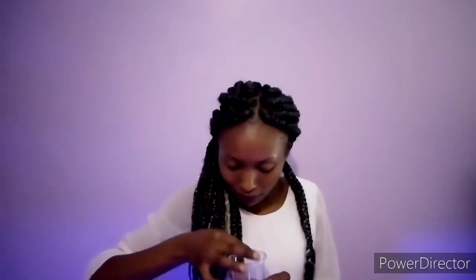Guys, this is my urine. So make sure you take a new test. Here I had removed it, so I'll have to hold the grip part, the part where there is no maximum limit, and I'll insert it directly. I have to make sure that it doesn't pass.